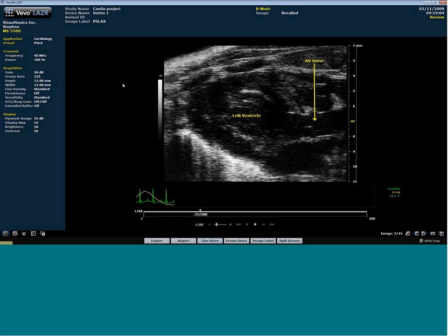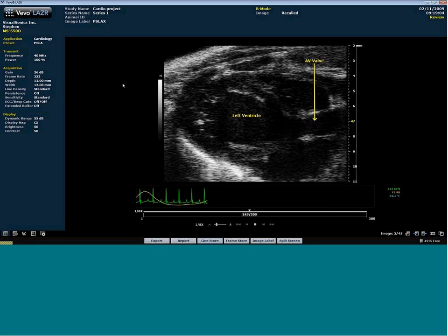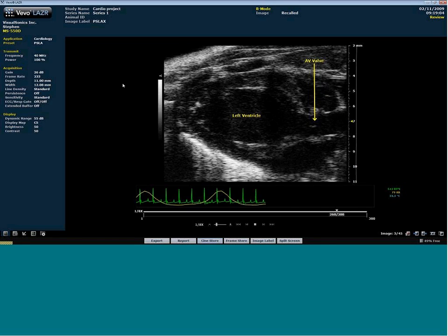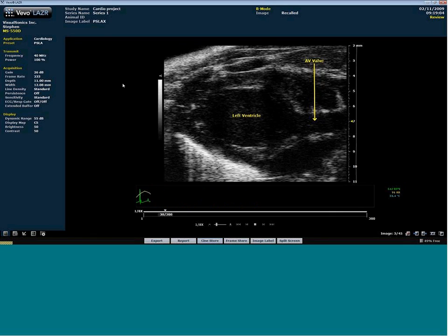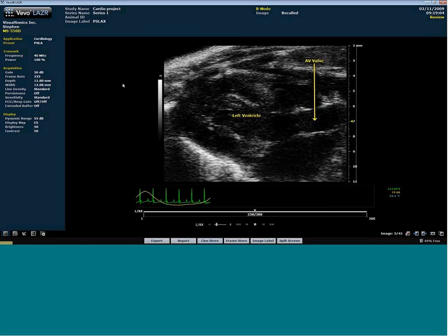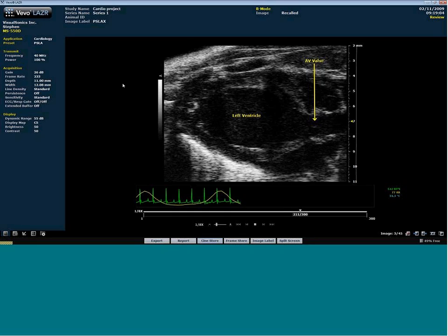It doesn't give you a clear indication on the screen on the 770 that you have that preset, but if you know it's a specific preset, you can just go into that Operator Preferences window, recall it, and work with it from there.